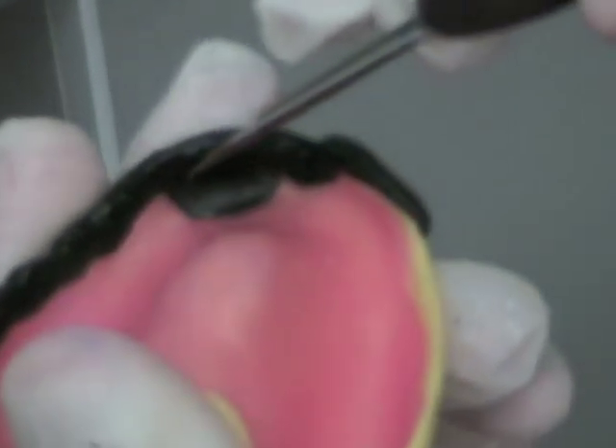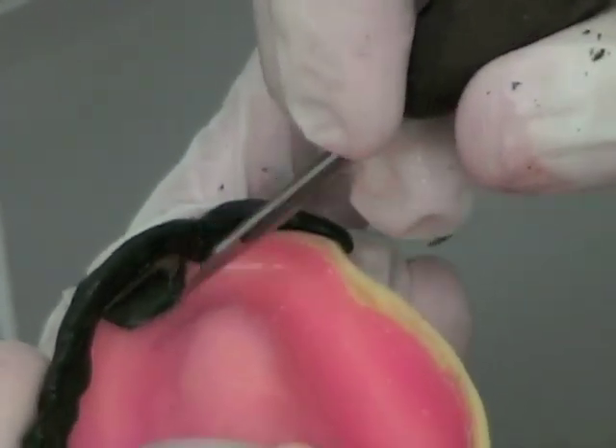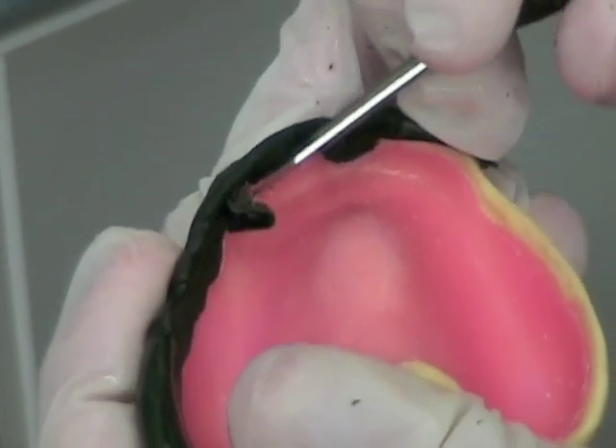You don't want compound to fold underneath the tray and actually raise the tray away from the tissue. If some of the compound does fold over there, heat your scalpel blade, cut a line through the compound, and remove it from the spacer.